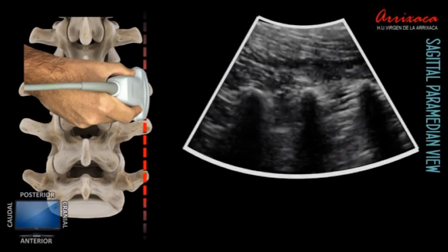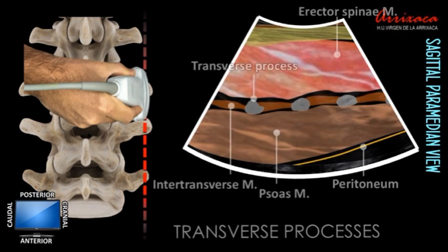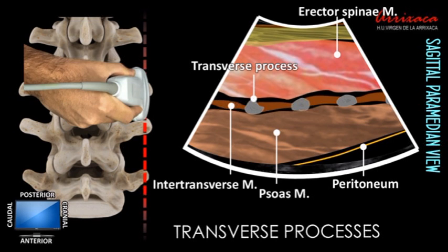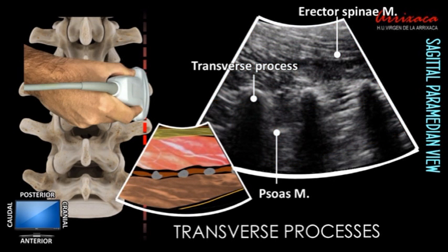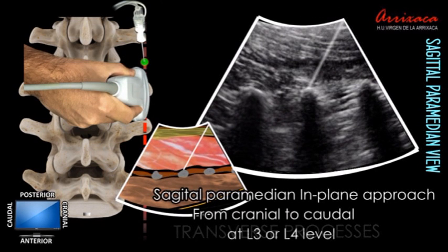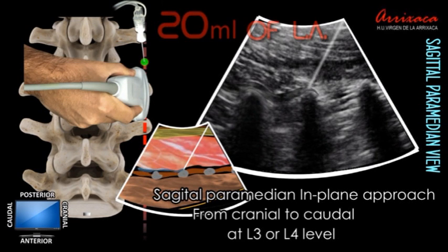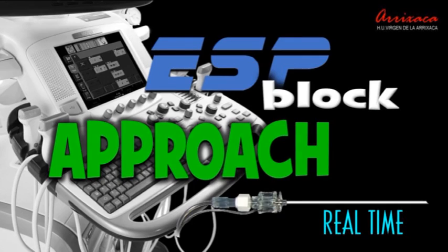The transverse processes are identified as finger-like acoustic shadows separated by the striated psoas major muscle. The erector spinae muscle lies superficial to the transverse processes. The needle is inserted in-plane and directed cephalic to caudal, one or two spaces above the surgical target. 20 milliliters of long-acting local anesthetic solution is then carefully injected.